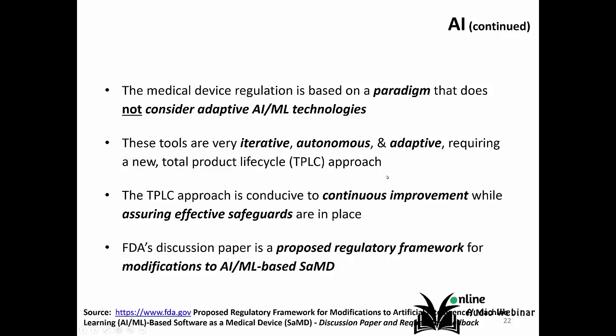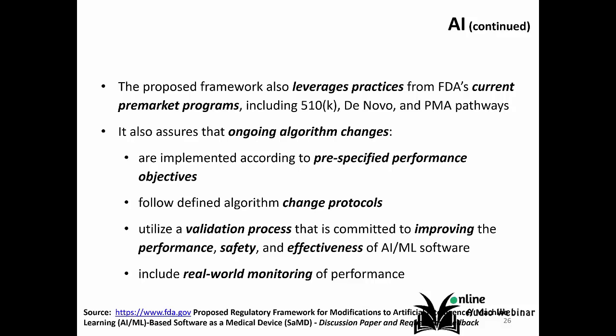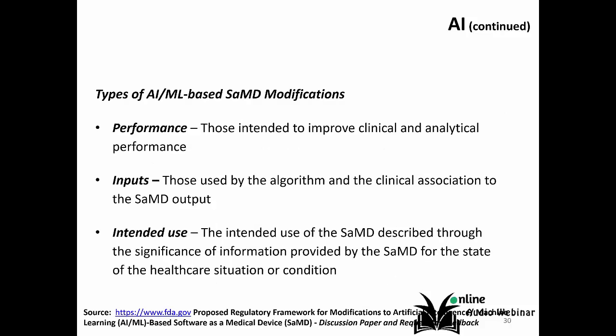Medical device regulation is based on a paradigm that doesn't consider adaptive AI/ML technologies. The paper is for feedback and discussion only, not a draft guidance, and it describes an innovative approach. The proposed framework leverages best practices from FDA's current pre-market programs: the 510(k), the De Novo, and the PMA pathways. The types of AI/ML-based software as a medical device modifications include performance, inputs, and intended use.